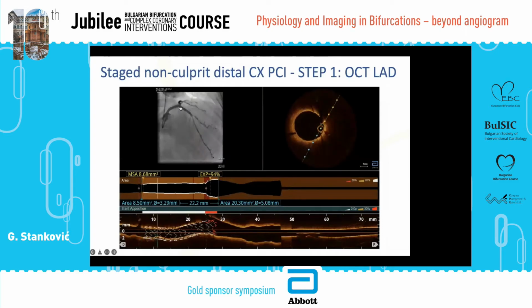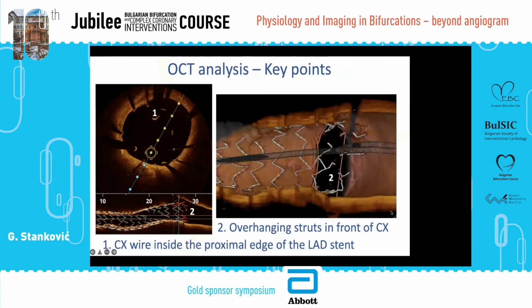But when we saw this angio, we had suspicion that the stent in the ostium of the LAD protrudes into the left main. Use of OCT showed us good expansion in the LAD, but also a long 4 millimeter protrusion of the floating struts of the stent from the LAD into the left main.